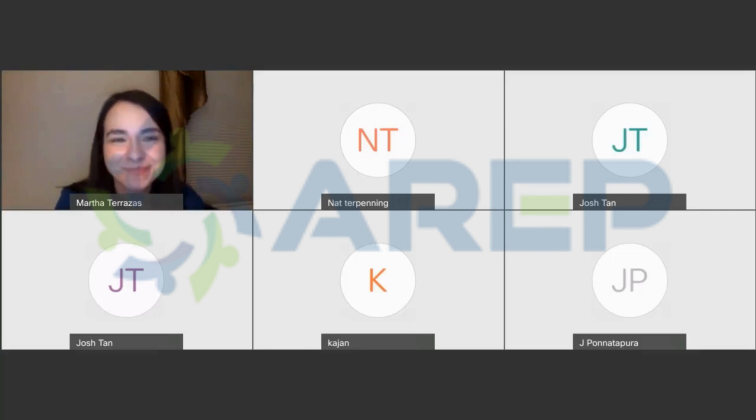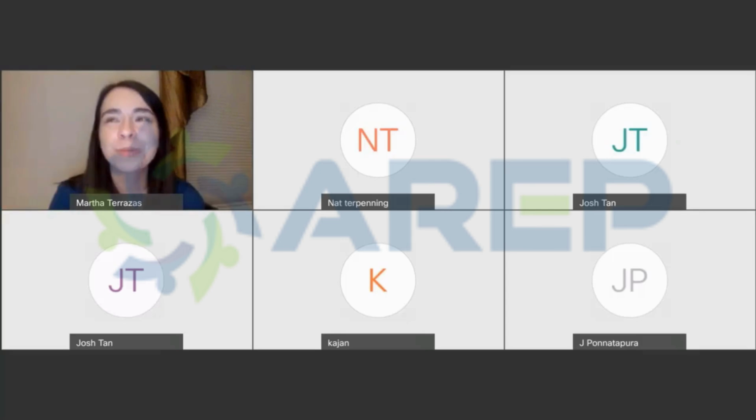Is there any new exciting gadolinium in liver imaging that helps you a lot in differentiating the diagnosis? Any new things about the gadolinium contrast, or is it about the same as 10 years ago? It's about the same, with our hepatobiliary specific agents. It's been pretty much the same that I know. Thank you, Martha. Thank you.